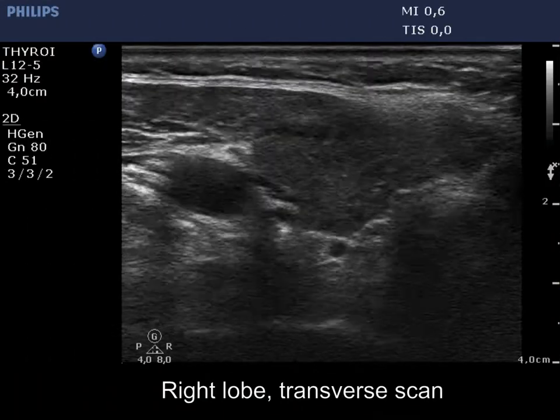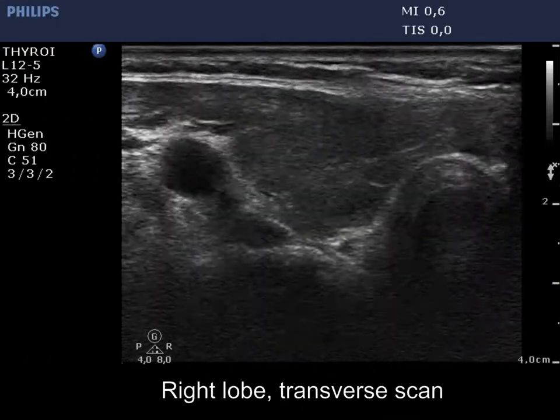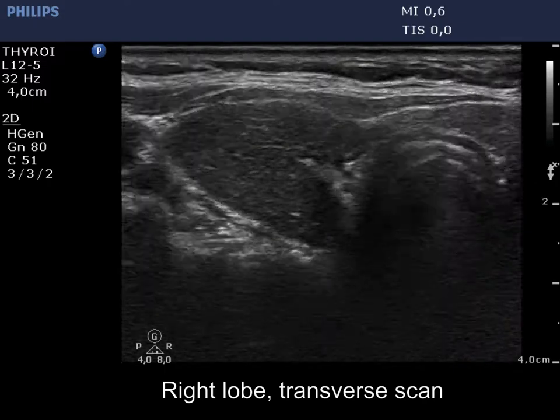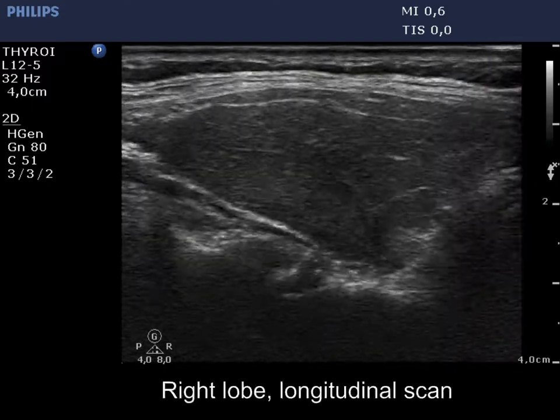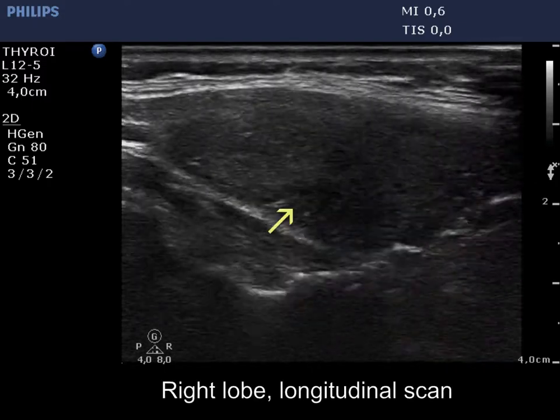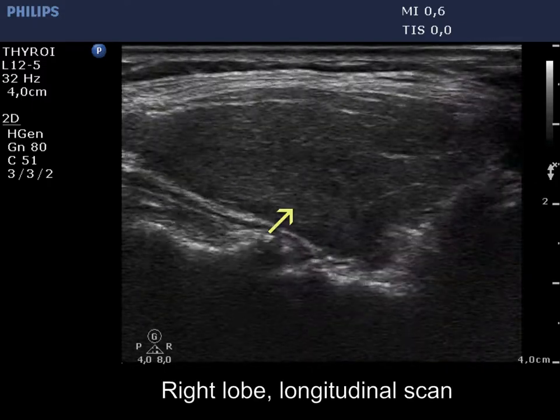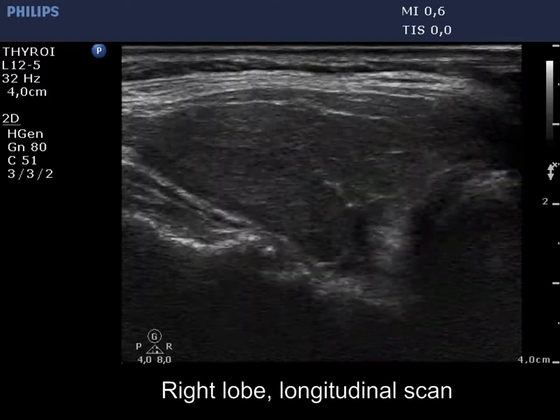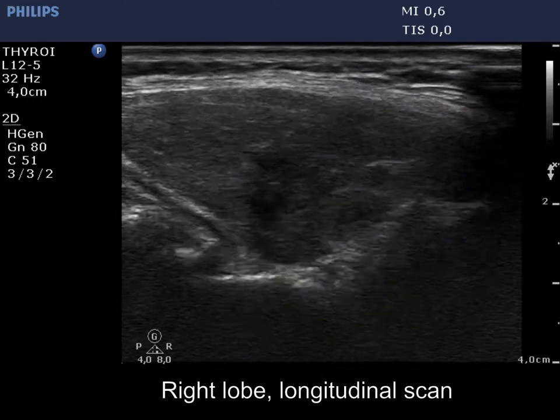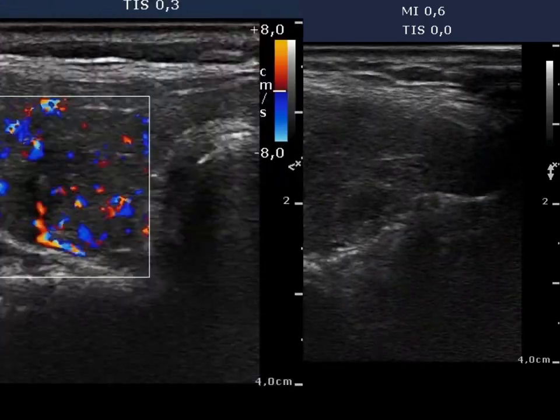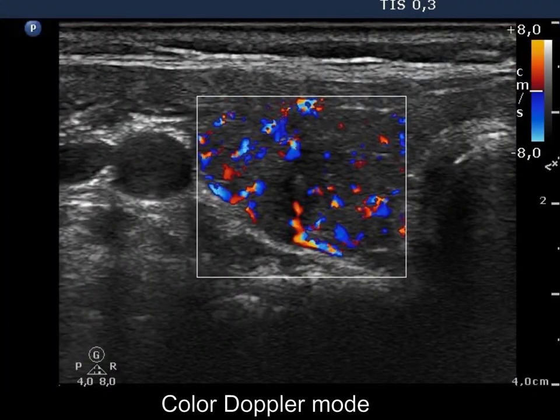The right lobe is hypoechoic and contains several small, discrete areas, including one showing non-parallel orientation. The vascularization is increased.